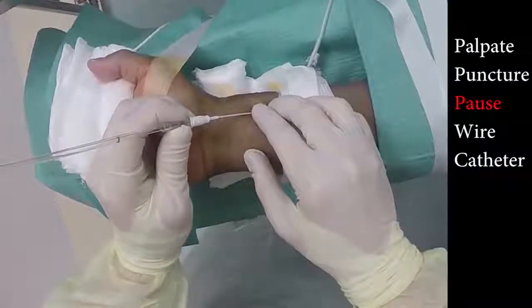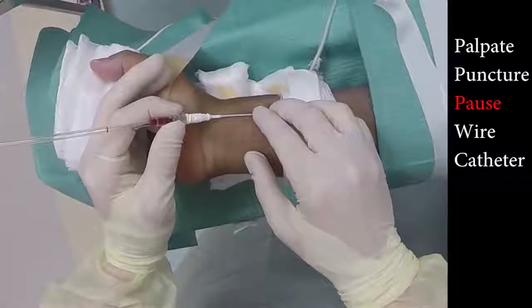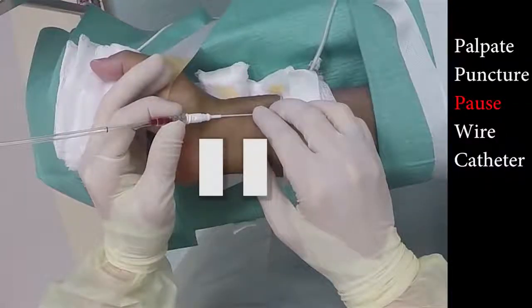Step 3. Pause. This begins once puncture of the artery has occurred and blood begins to amass in the clear plastic chamber behind the Arrow kit. Most problems arise at this moment, and we're going to try to mitigate them right now.